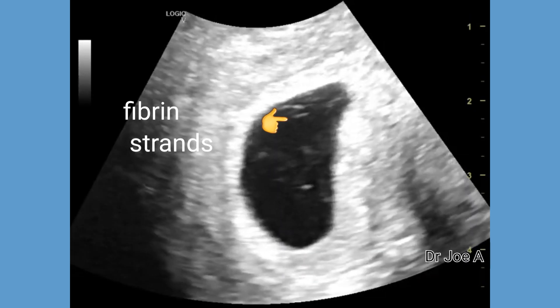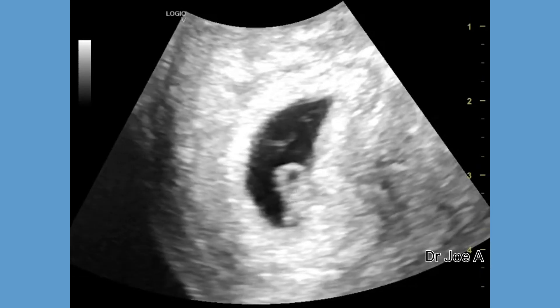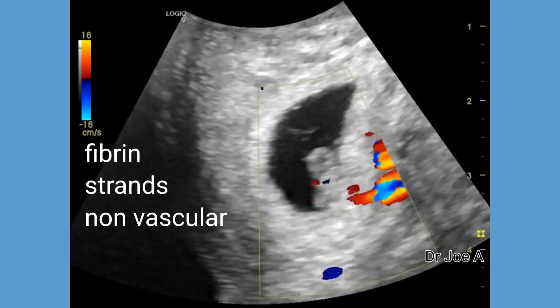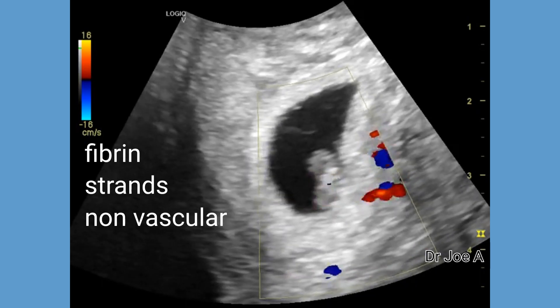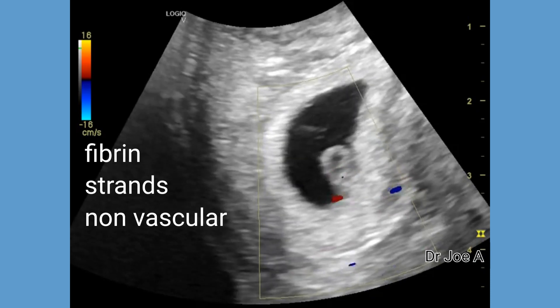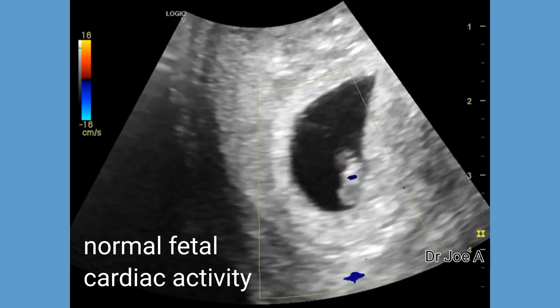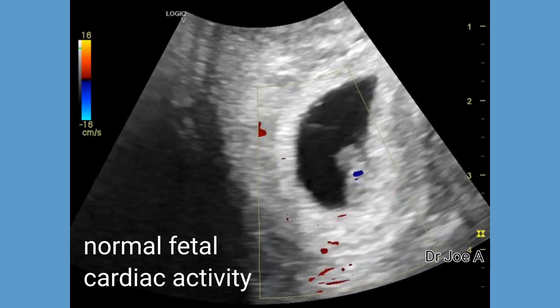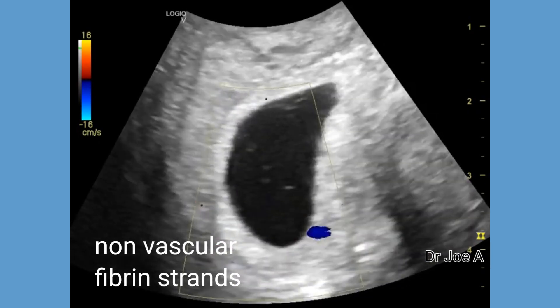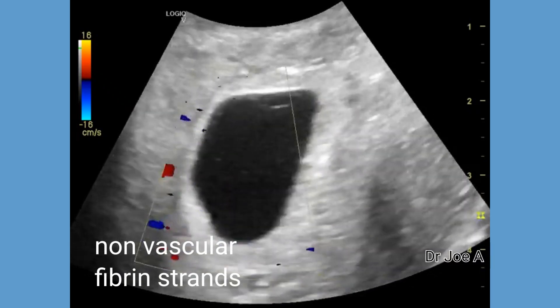What are the important differentiating features of fibrin strands from amniotic bands? First of all, fibrin strands are thin and wispy while amniotic bands are thicker and more fibrous. Fibrin strands are also usually mobile within the gestational sac while amniotic bands are fixed and do not move. On color Doppler, fibrin strands show no vascularity. Also, fibrin strands are usually seen in early pregnancy while amniotic bands are more commonly seen in the second or third trimester.